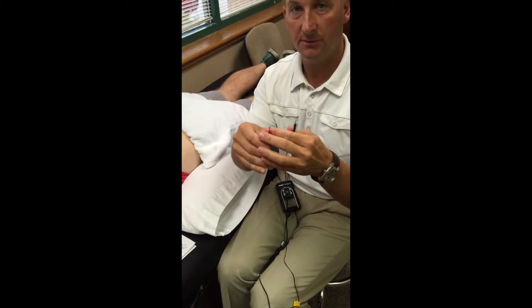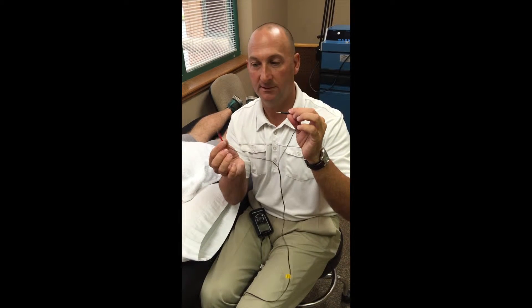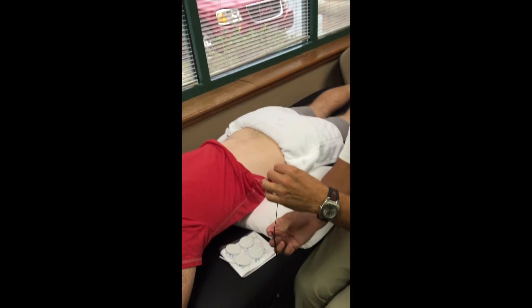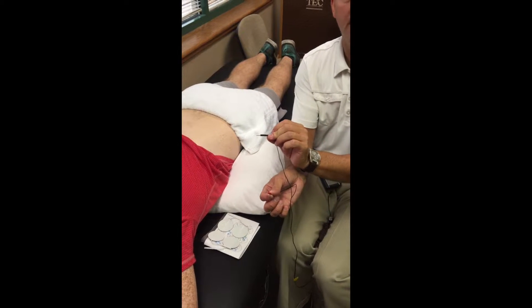When I went through school they used the analogy that you want to have smoke over fire. So if the red lead is the fire and the black lead is the smoke, most of the time you'll want to apply the setup in that arrangement.